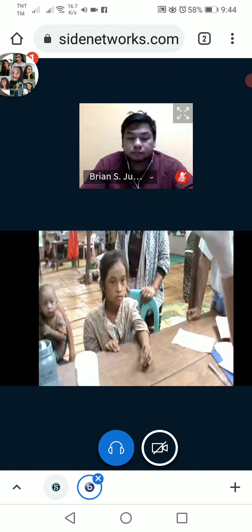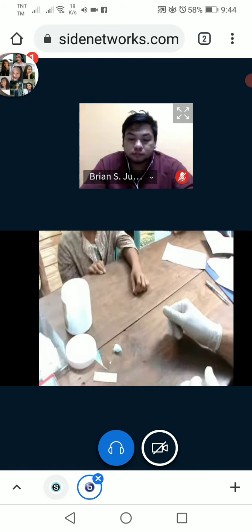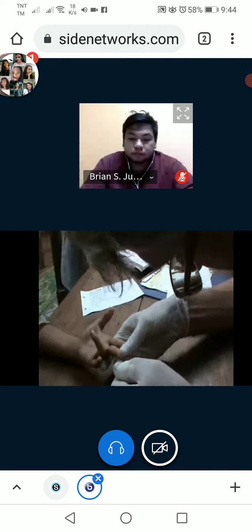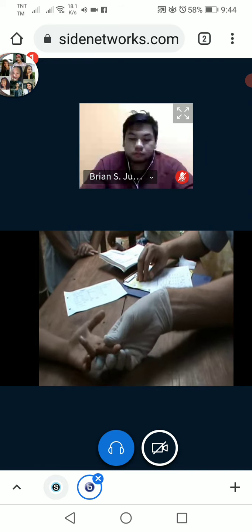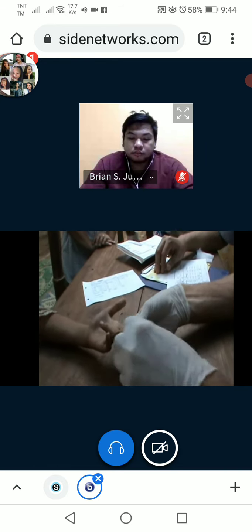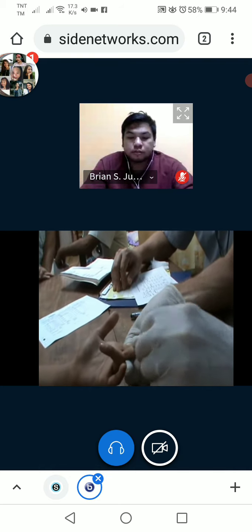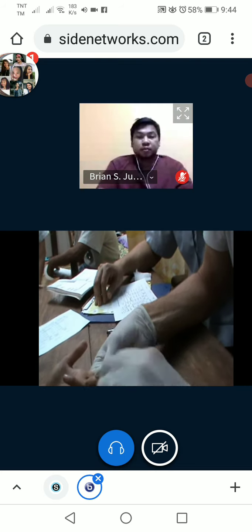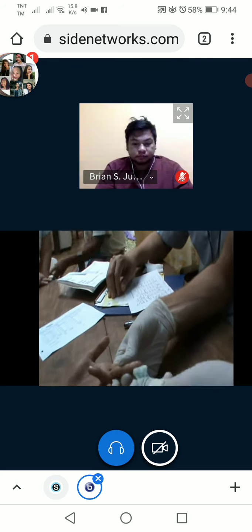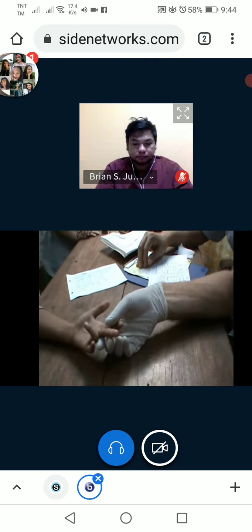Note here that the slide can be manipulated as long as you keep your finger on the edge of the slide. Massage fingertip to increase blood flow. Clean the fingertip thoroughly with a cotton ball soaked in alcohol. This step needs to be done properly in order to avoid contamination of the blood taken or infection for the patient. Open the protective wrapper of the sterile blood lancet from the back side.